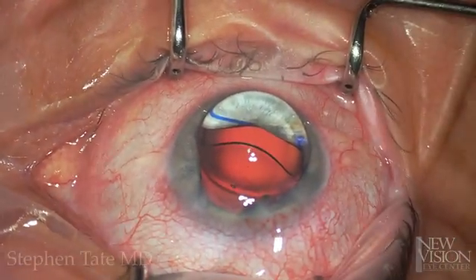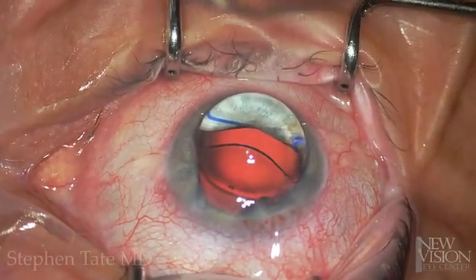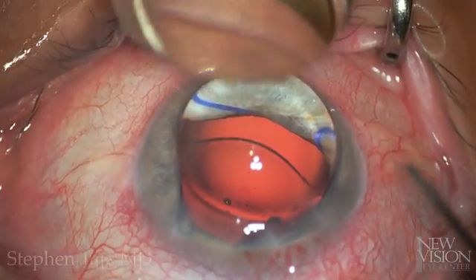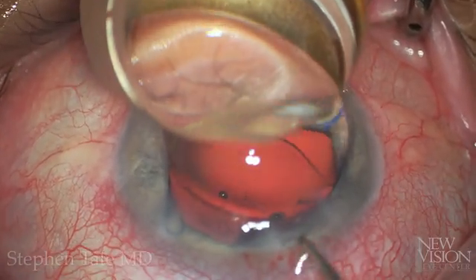Number one is patient positioning. Patient chin down for surgeons operating from the head, and patient turned away from the surgeon for those operating from a temporal approach.